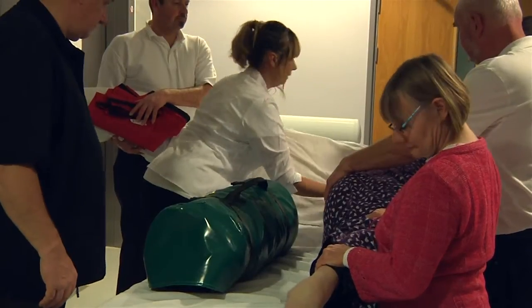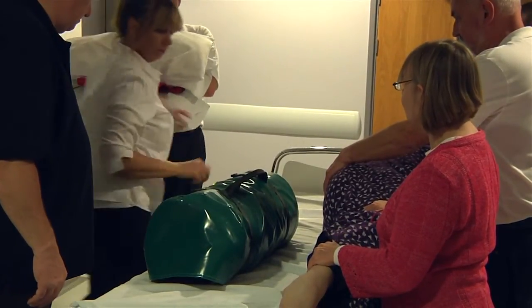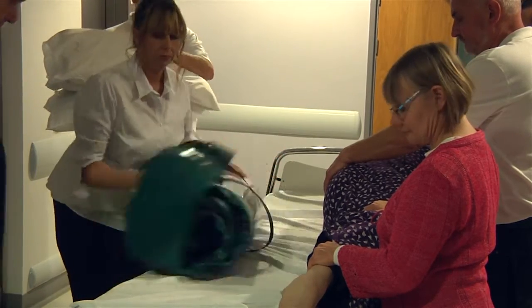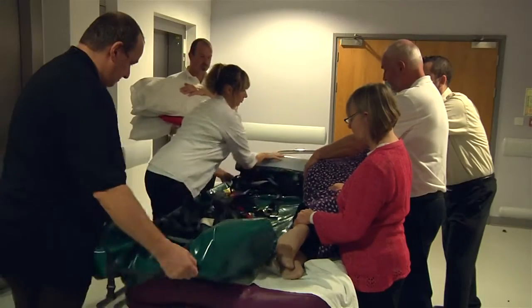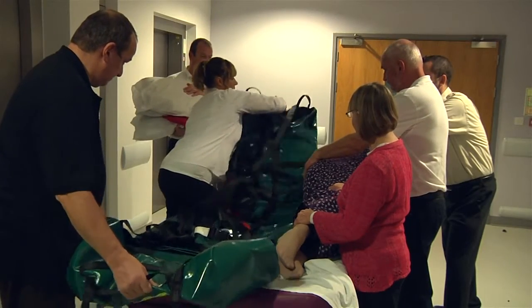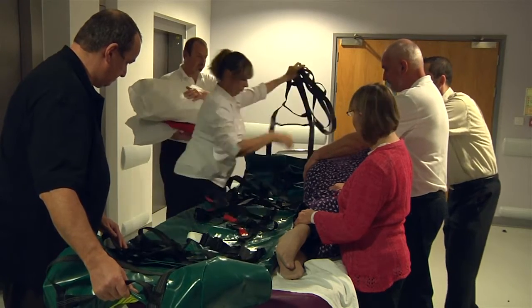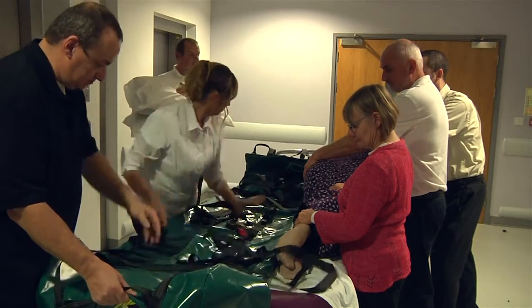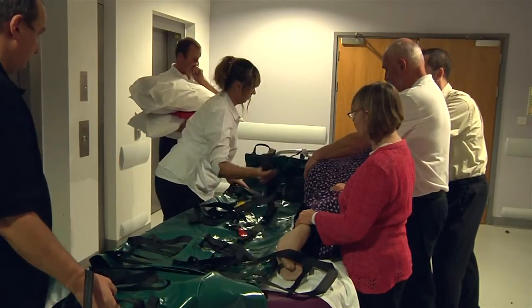Remove the patient's pillows and put to one side ready to use later. Release the two holding buckles and unroll the evac mat ready for use. Release the buckles on the cross straps and unfold the evac mat.